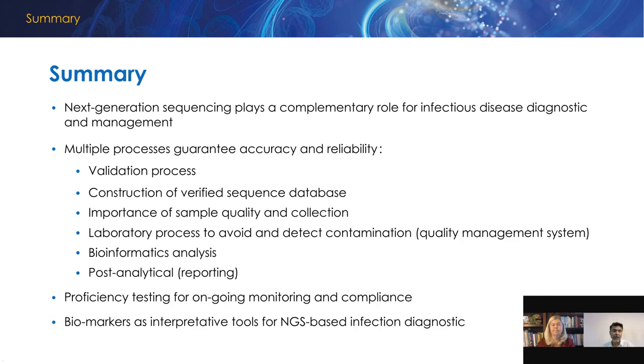And in the case of fungi, especially molds, we know the molds are technically challenging for identification. We need staff that have experience and expertise in identifying molds microscopically. We need to have the environment for them and the special media. So that's one of the advantages of NGS: it is an agnostic method that will be able to provide identification of any of the mold present in the sample in a short period of time, without requiring all the technical expertise that a mycology laboratory can require.